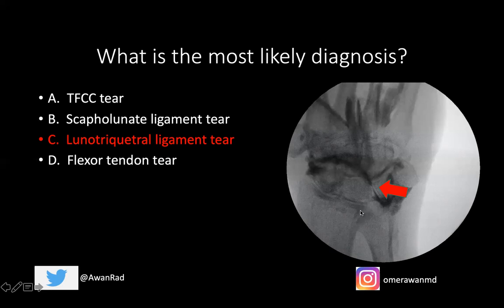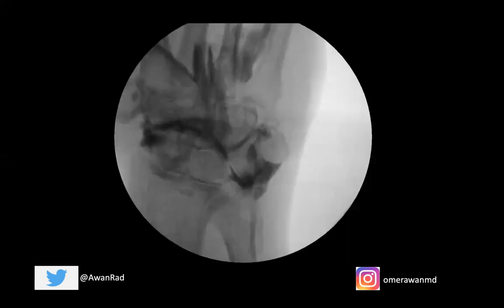So this is a nice case of what a lunotriquetral ligament tear would look like. We can see it very nicely — the contrast outlined here in the lunotriquetral space.